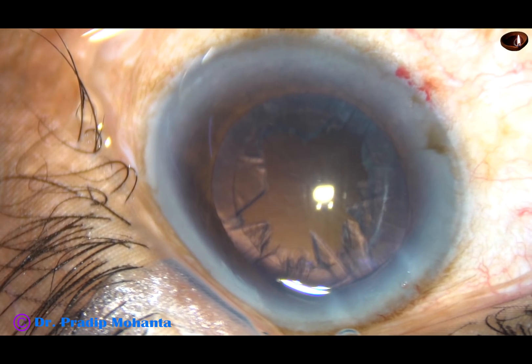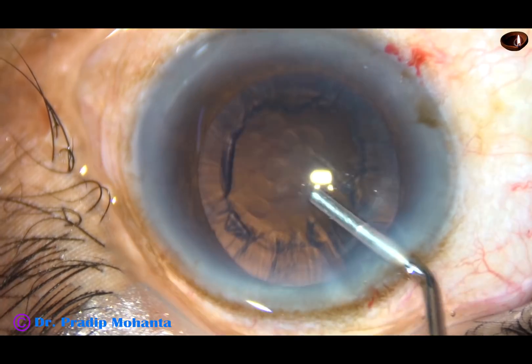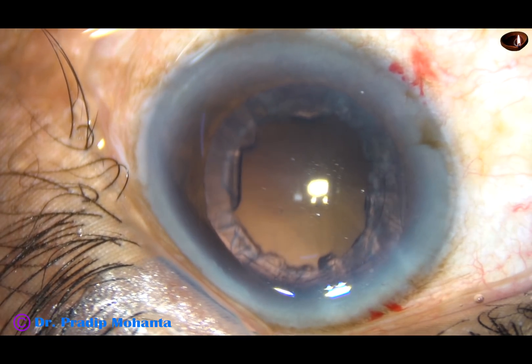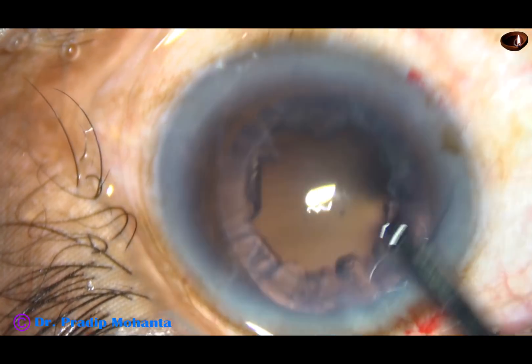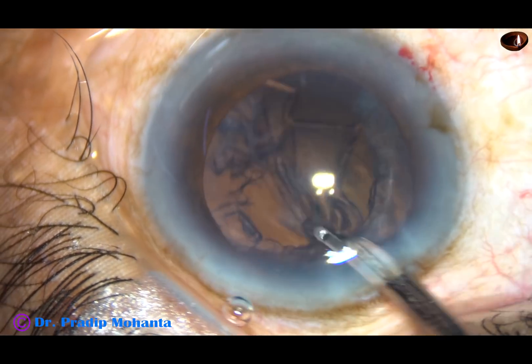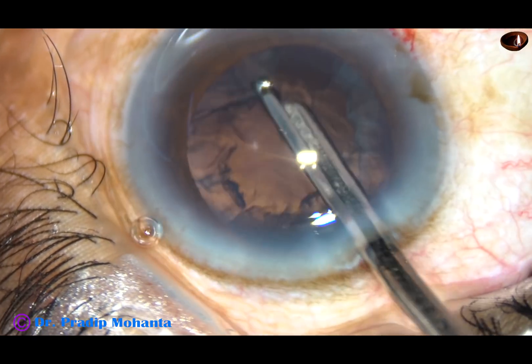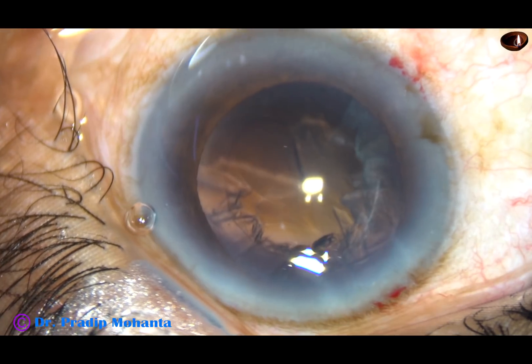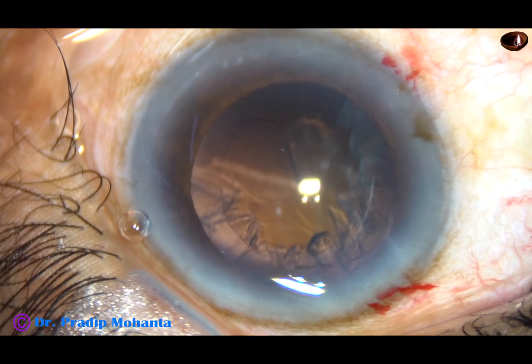Now viscoelastic substance is injected into the anterior chamber. By the time my assistant gets ready with bi-manual, I can remove some portion of the cortex by a Simcoe cannula. That's it. And now I take the bi-manual.